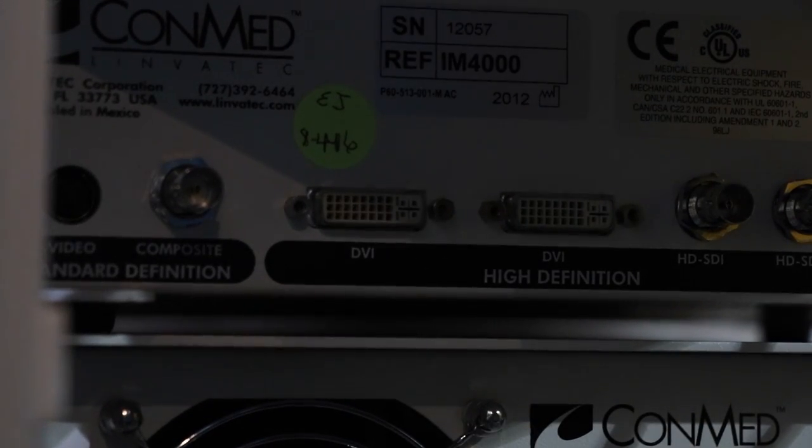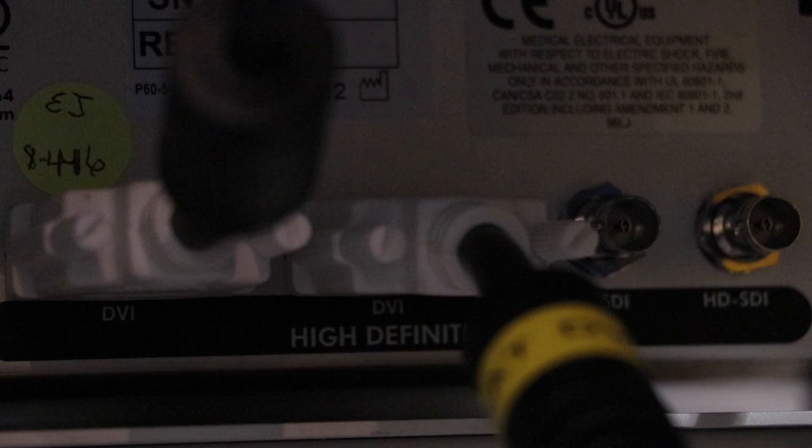Let's plug in our first DVI cable to the back of the IM4000 and go ahead and plug that into the back of the VP4726.